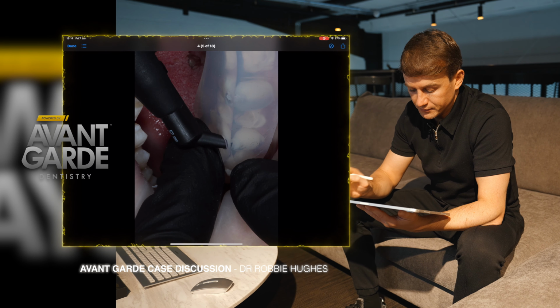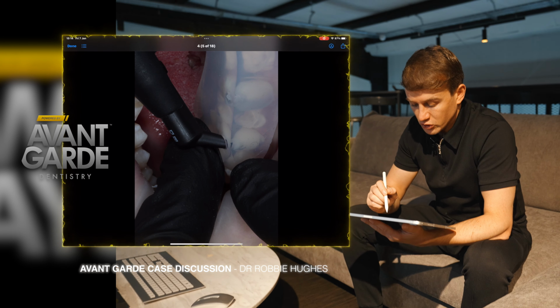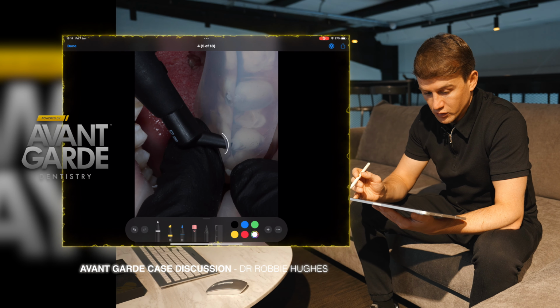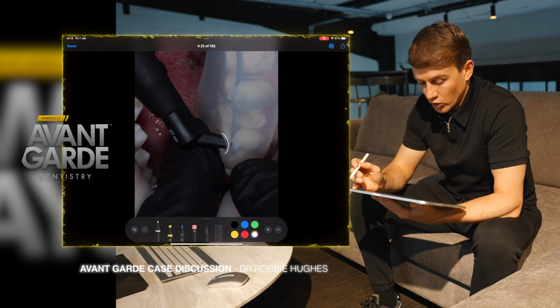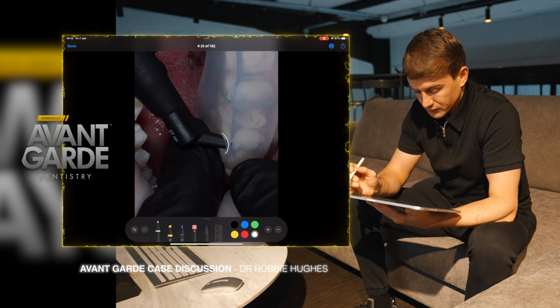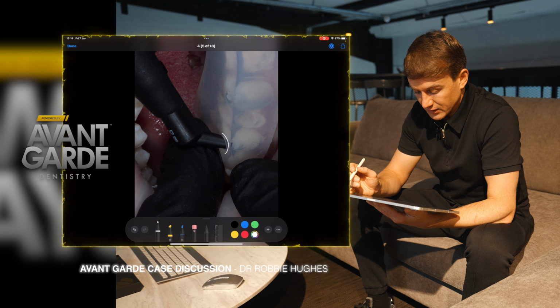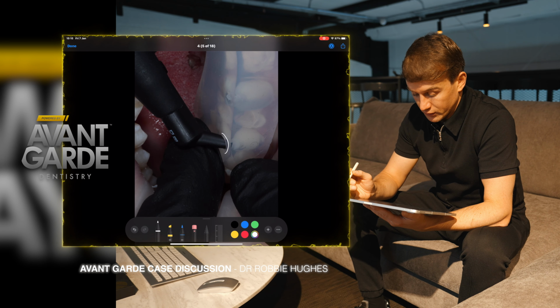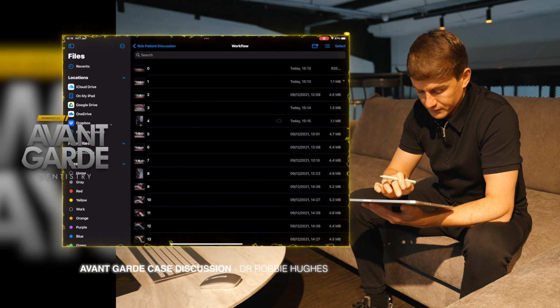So we go ahead and do that. So the stents are specifically designed to allow a perfect fit of the composite capsule from Ivoclar Empress Direct into the stent, heated composite, heated on the Bryant dental heaters to around 60 degrees Celsius, gives a nice flowable consistency, and that's injected slowly into the stent individually, one by one, cured each time before the stent is removed again.